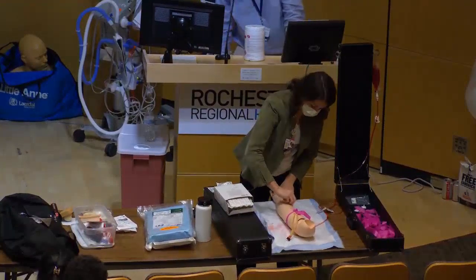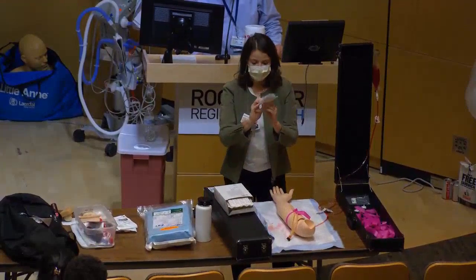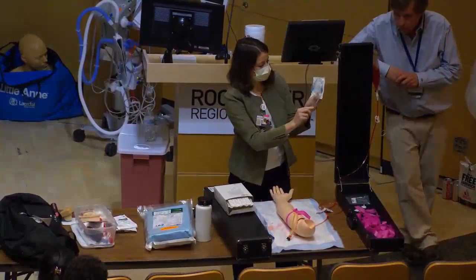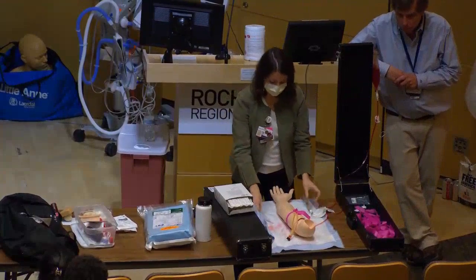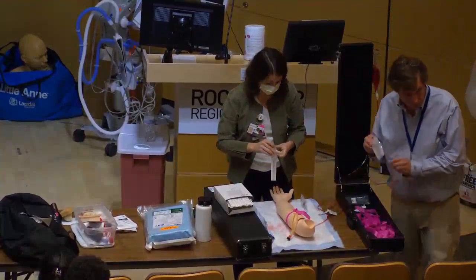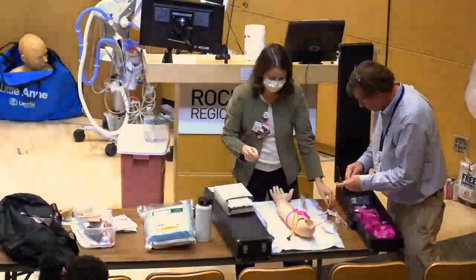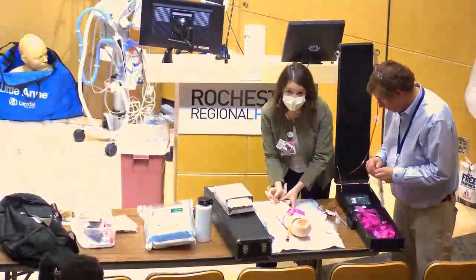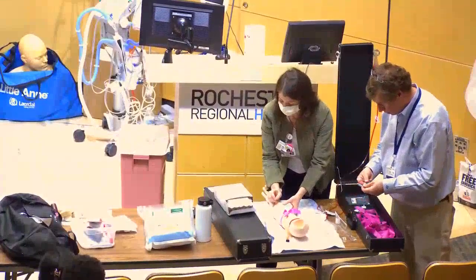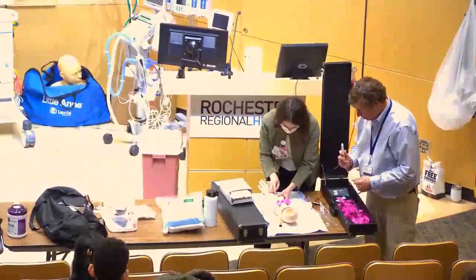You can often see veins that look dark and blue, but if you try to compress them and there's nothing there, you won't be able to get a catheter in. Once you find a good vein, clean the area with chloroprep or alcohol and let it dry. While it dries, prep your IV connecting tubing, saline flush, hook the flush up, and prime it through. You'll obviously have gloves on, and go in at about a 15 to 20 degree angle — not 45.